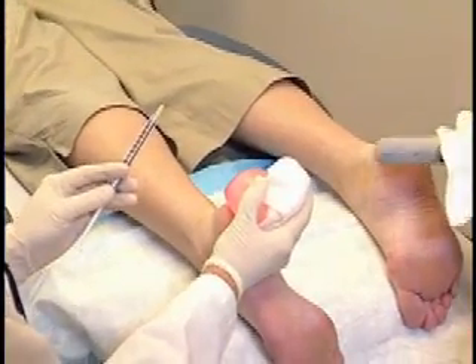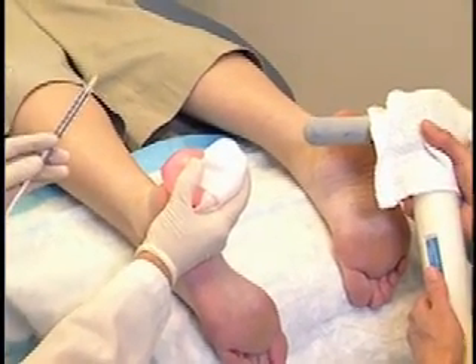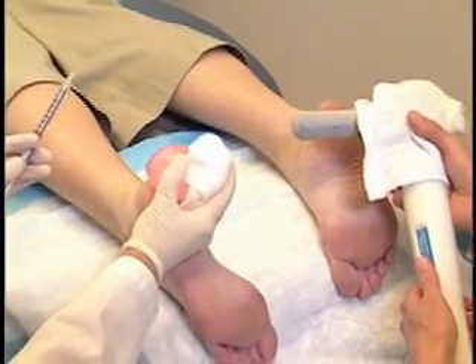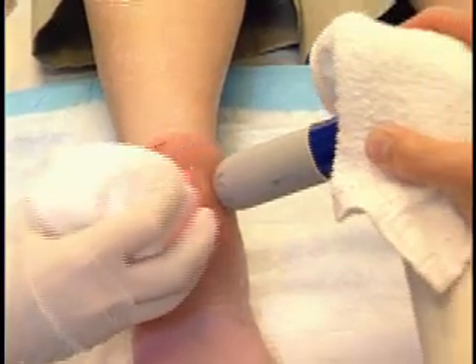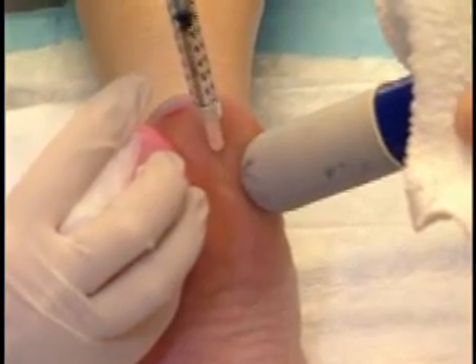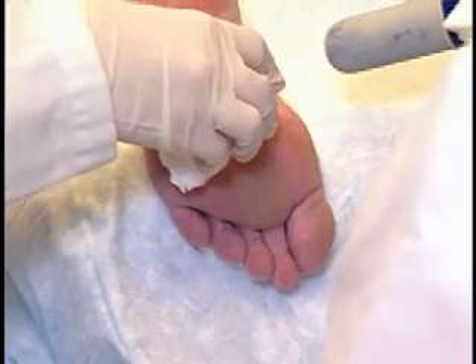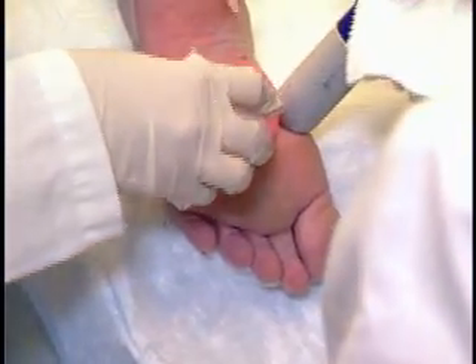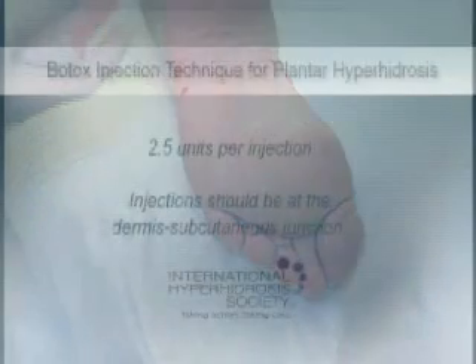If needed, you can use a template to mark the injection points on the foot. For each spot to be injected, apply the water balloon with firm pressure for a count of seven to ten. Apply the vibrator right next to the planned injection site for a count of three. Make sure to apply pressure with the ice and the vibrator. After the three count, inject the site with 2.5 units of the solution.